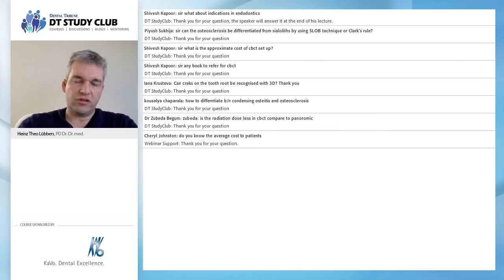What you need to do is you better go to a course or meet in a study club and then have a close look at CBCTs. And it's like with computers. It's learning by doing. You don't learn to use PowerPoint by reading a book about PowerPoint. Theoretically you can, but practically, at least for me, it's not working.